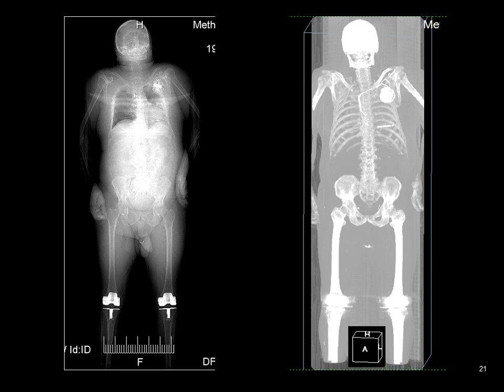These are both examples of CT scans on the same patient. Actually, on the left, we have what we call the scout view. For example, if you're at war, you would send out a scouting party to observe or survey the enemy covertly. And that's exactly what a scout view is. It's a survey view before we get to our detailed views using CT scan technology. And then on the right is a CT scan of the patient using a bone filter.